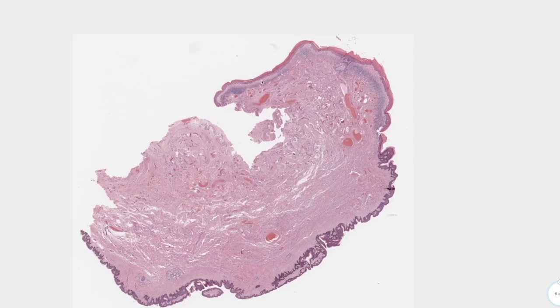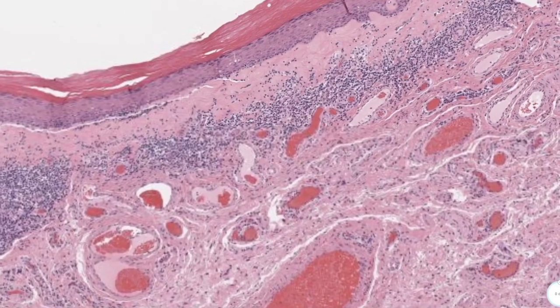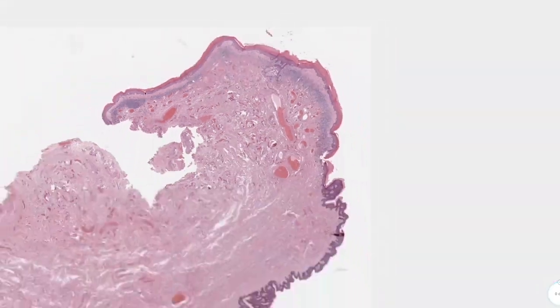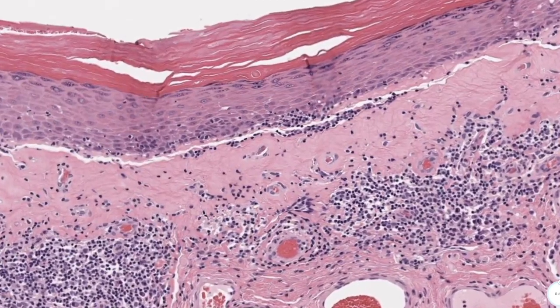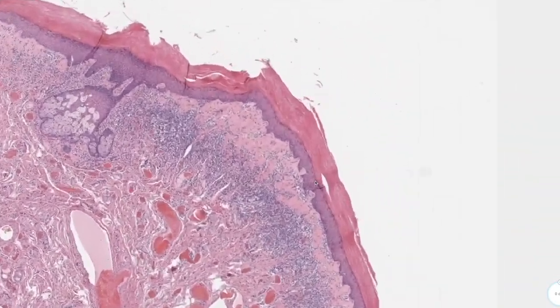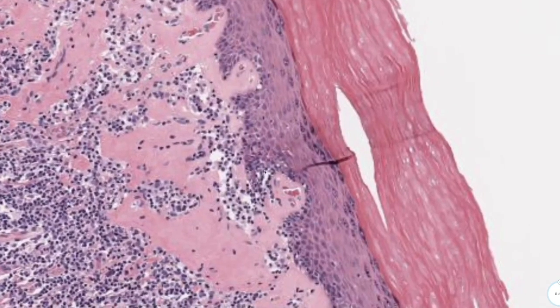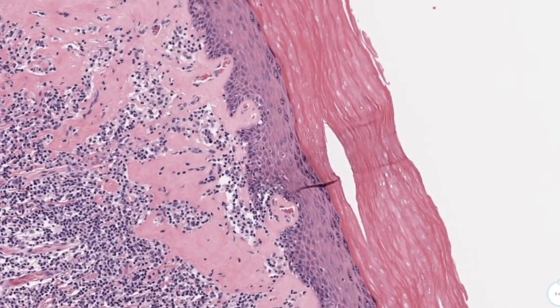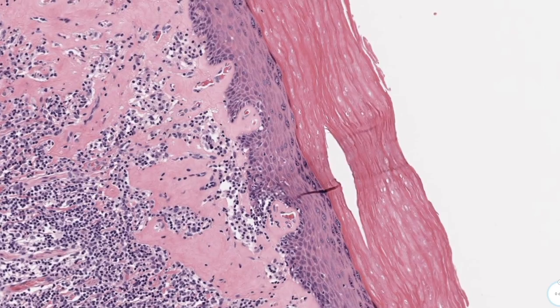At higher power, this is basically an inflammatory process — lichen sclerosis of the penis, or penile lichen sclerosis. It is a lichenoid reaction. We can see a lichenoid infiltrate with interface dermatitis, where lymphocytes are infiltrating the dermo-epidermal junction.